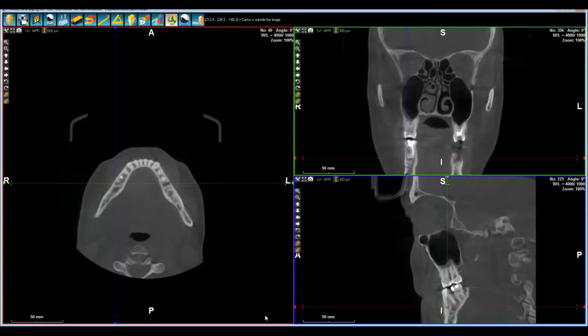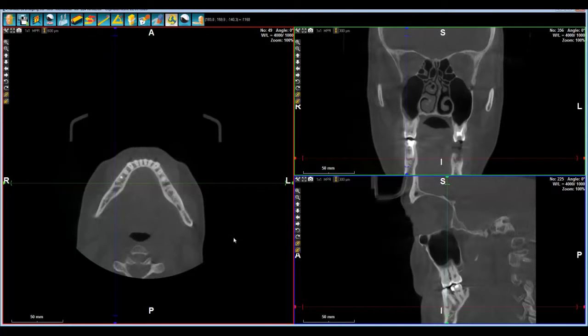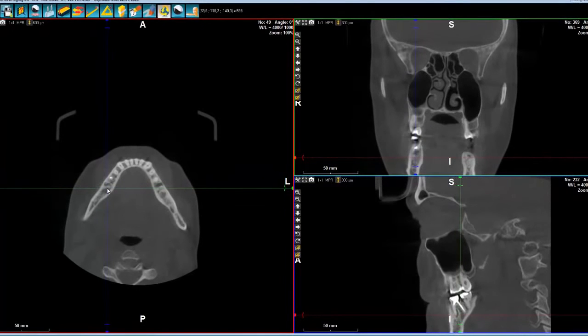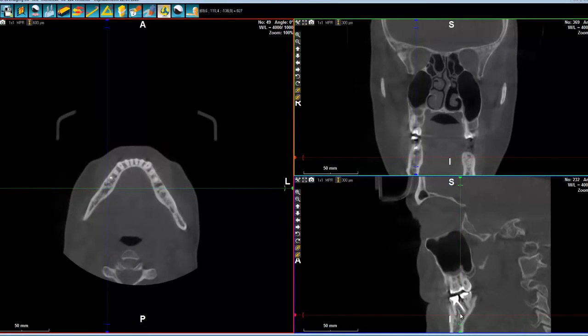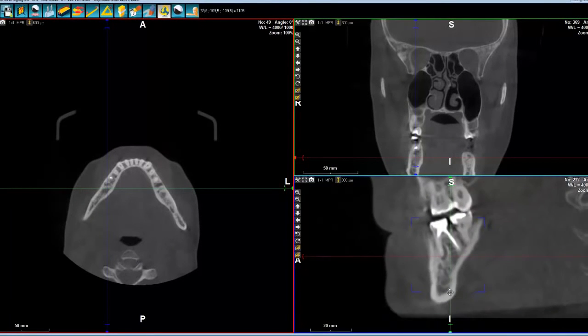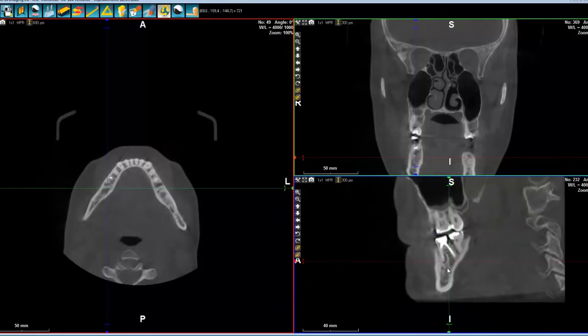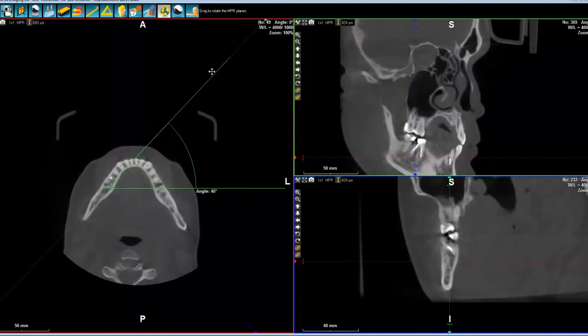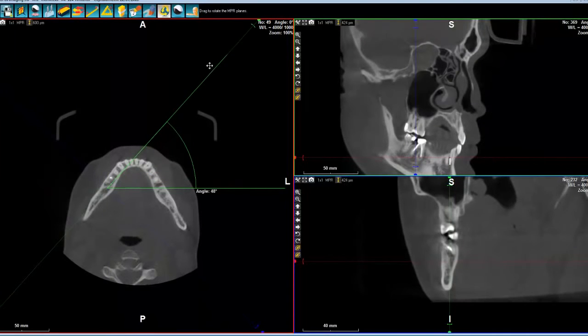So how do we do a report? Very easy. You do your diagnostic. You just look, for example, here we see that there is something quite abnormal. So let's have a little bit of a look.